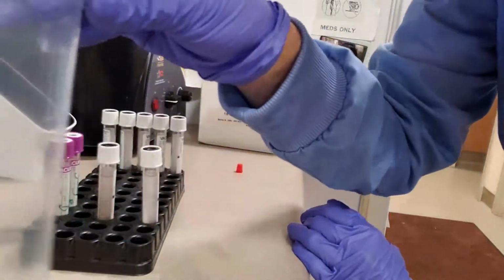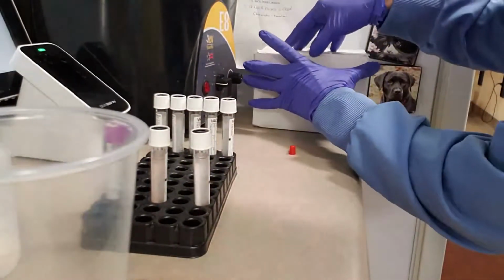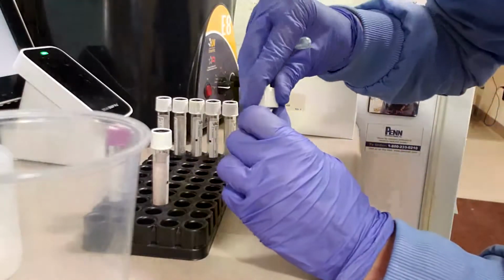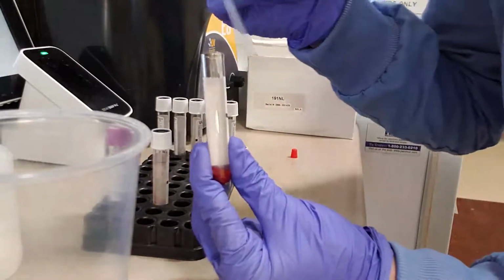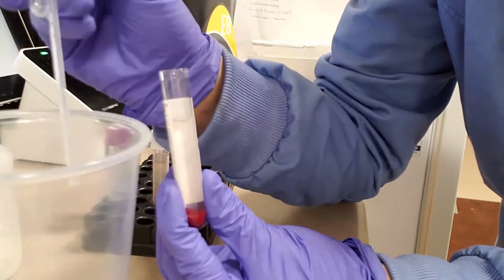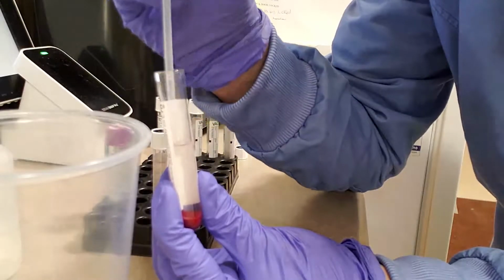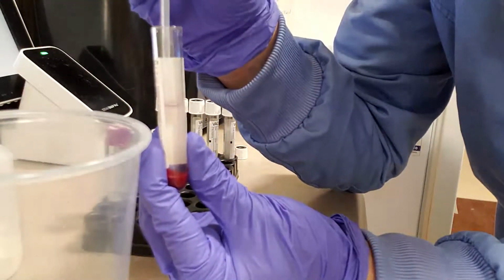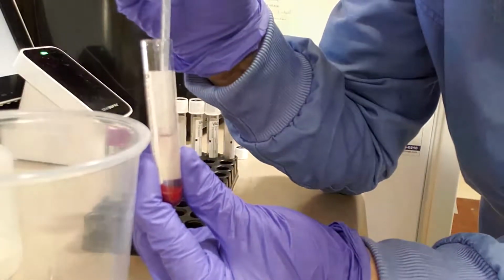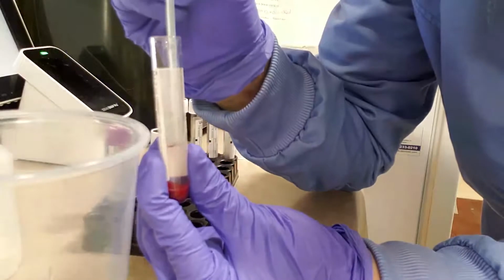and our donor. So now we're going to use just an extra little cup so that we can discard our dirty saline. So start with our donor, and we want to make sure that we are very carefully getting the supernatant without disturbing the red blood cells. So easy to do for the top portion, not so easy once we get closer in. The supernatant is pretty clear. If we did it 3 times and it still wasn't clear, we would want to do it again. But just because it's clear doesn't mean that we want to not continue with the rest of our washes.